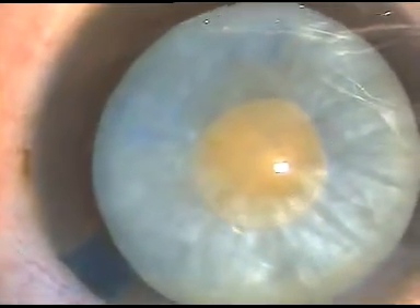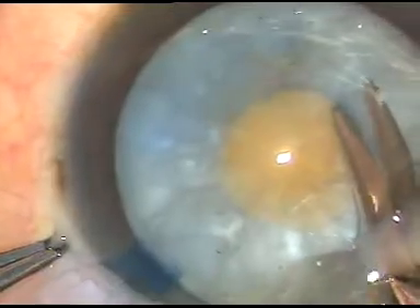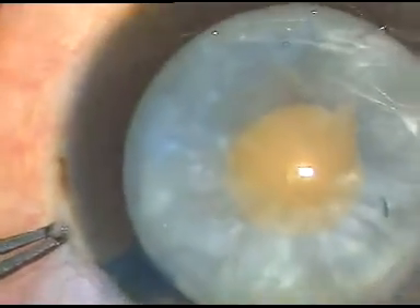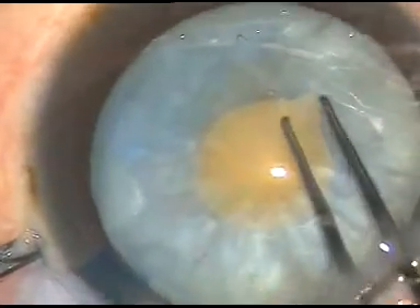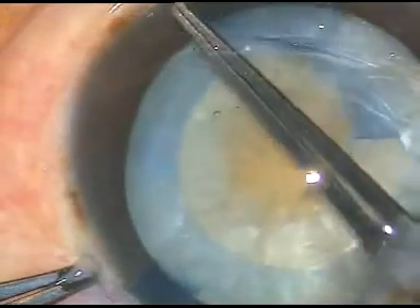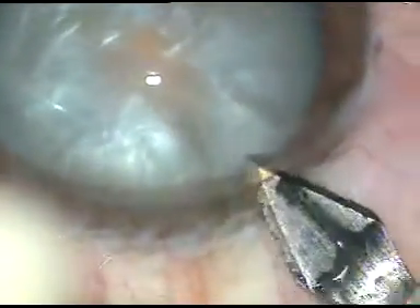Let's see how I can enlarge this rhexis. HPMC has been injected. Now this is a small cut, and I give another cut. Now I can hold this tag and enlarge this rhexis. I try to remain at equal distance from the margin of the dilated pupil, and thus I get a round rhexis in most of my cases.